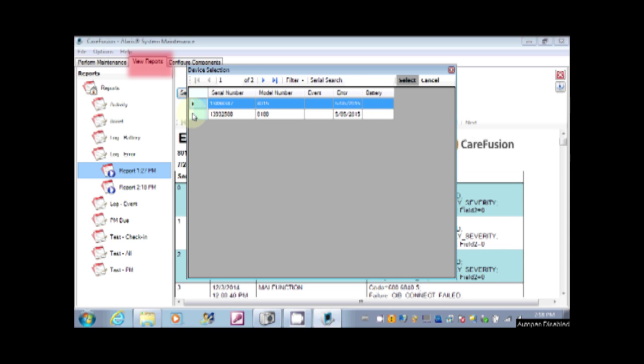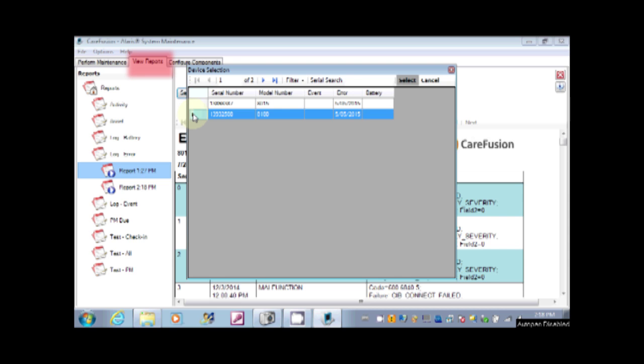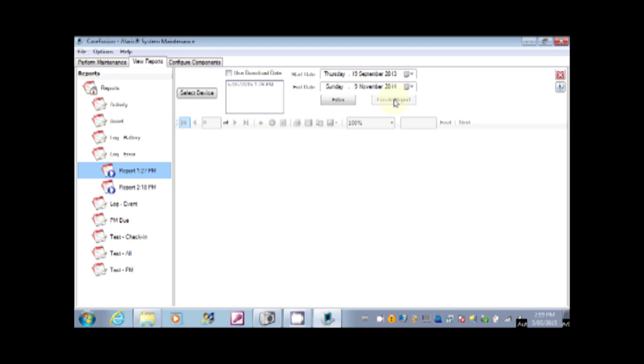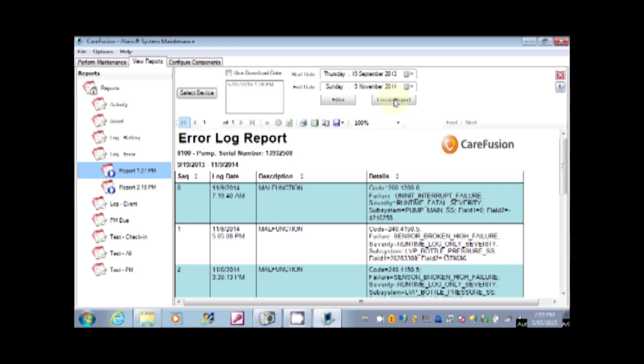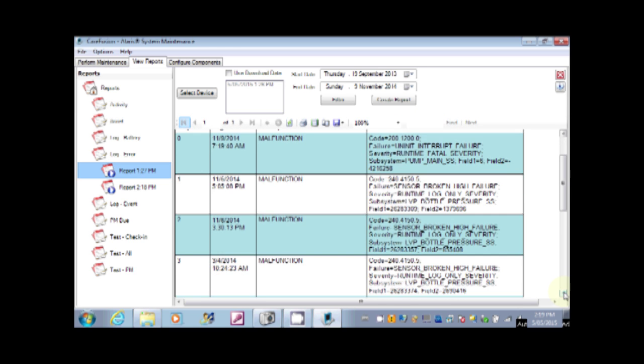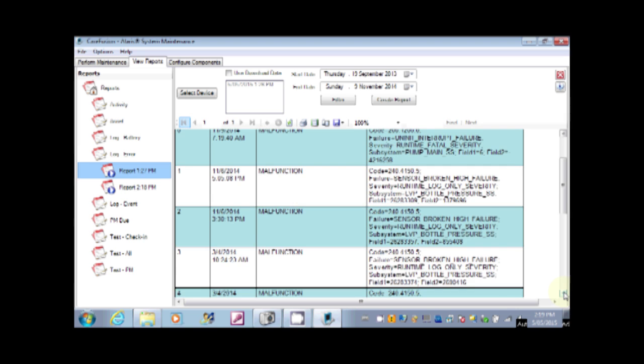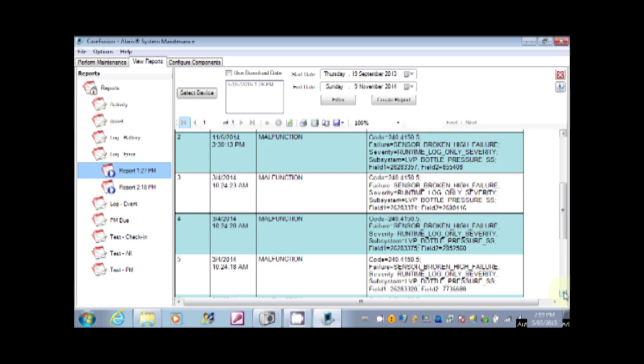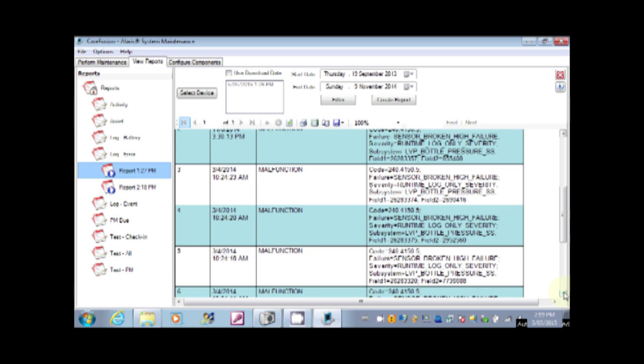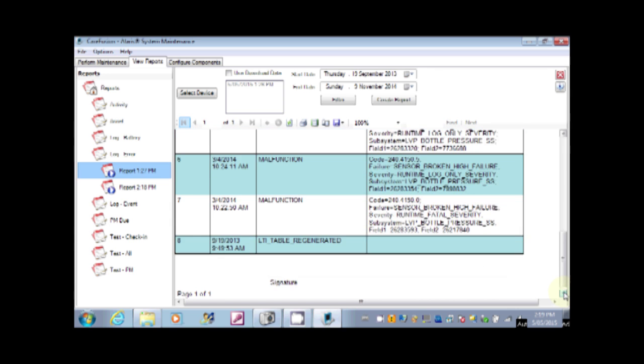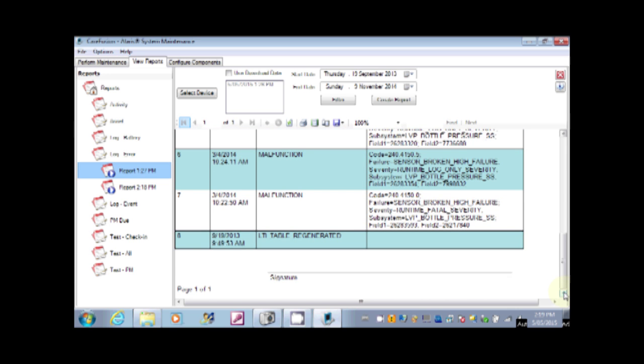You then go into the view reports tab. You select your device, either a brain or a pump. You then run the report. So it is kind of a two step process. You download the error log first, then you select the device and create the report. Once you have got the report there you can scroll through it and see the individual entries.